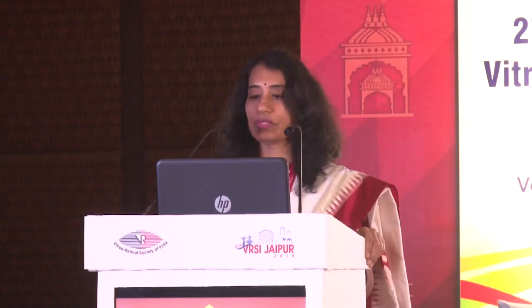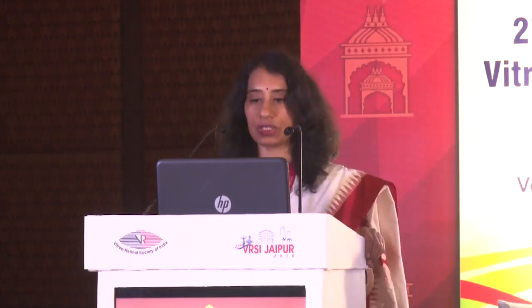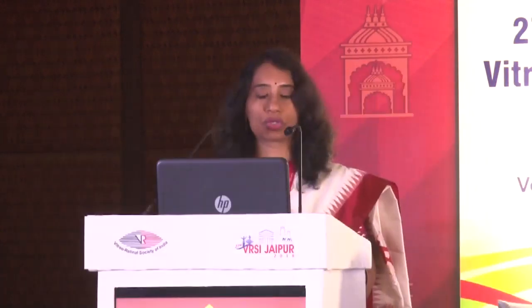Good afternoon, friends, and thank you, VRSI, for this opportunity. So my talk is on interpreting abnormal ERG. Let me first start with full field ERG. As you're aware, the ISCEV protocol talks about five basic responses. The scotopic ERG, which is a purely dark adapted response in which you have isolated rod response, maximal combined response, and oscillatory potentials, and the photopic ERG, which is photopic single flash and 30 hertz flicker response.